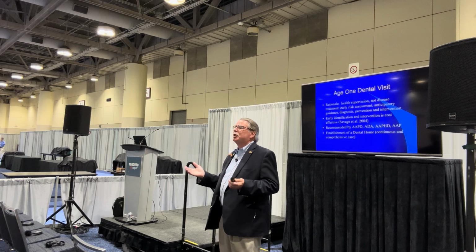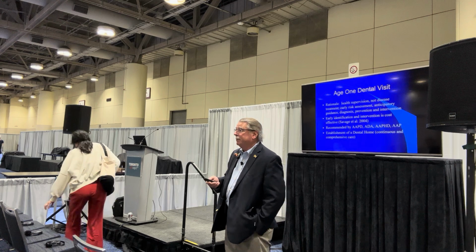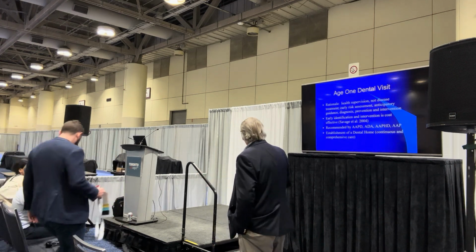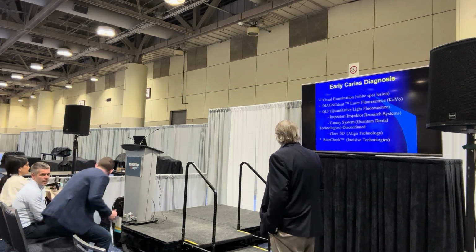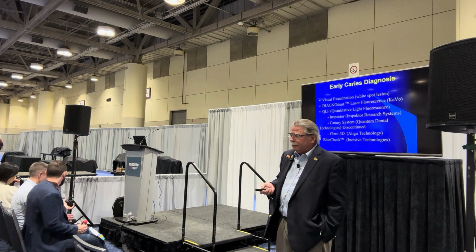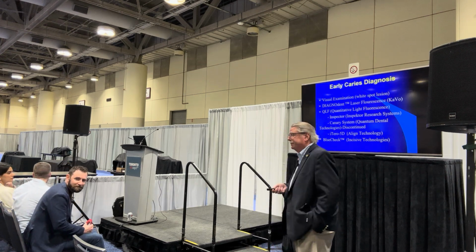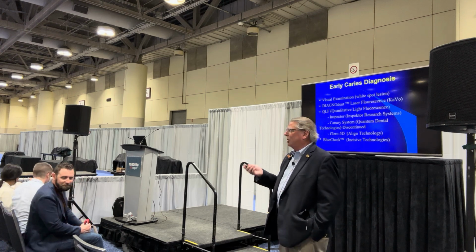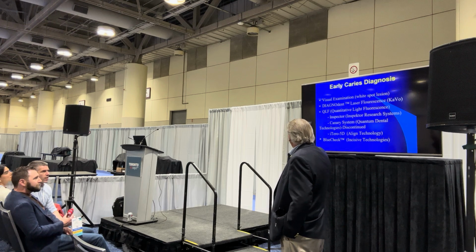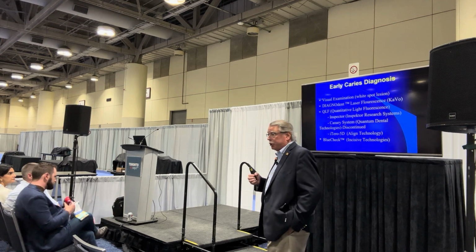But we couldn't see it visibly until it was a white spot lesion. And a white spot lesion is about a 0.5 millimeter, 500 microns by the time you see it. So, of course, we were recommended to find things earlier. And so we had a federal grant, a large federal grant, to start to look at early diagnosis. So we had put a group together. The principal investigator at Indiana was George Stuckey.